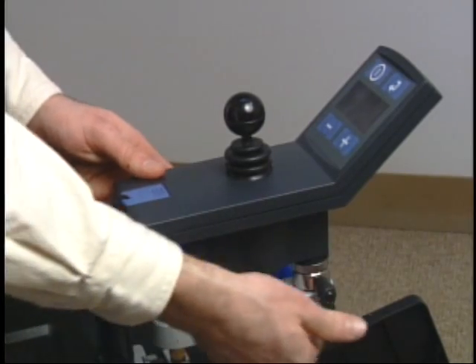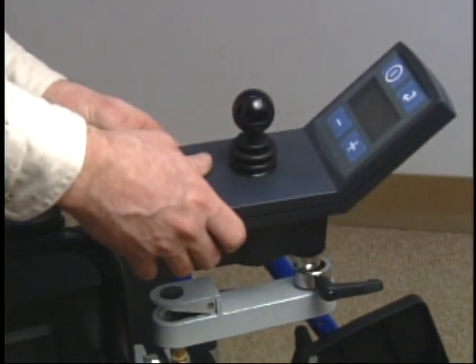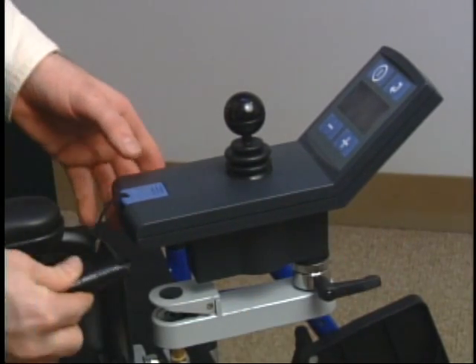A quick-release plug allows the user to separate the joystick from the wheelchair in seconds. This is especially helpful when traveling on airplanes to protect it from getting damaged.